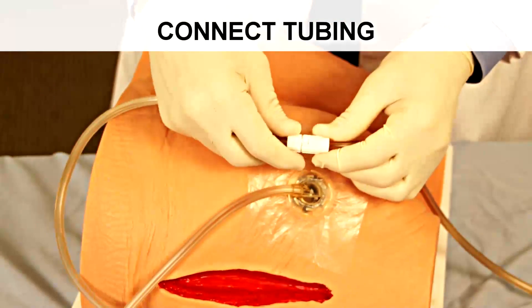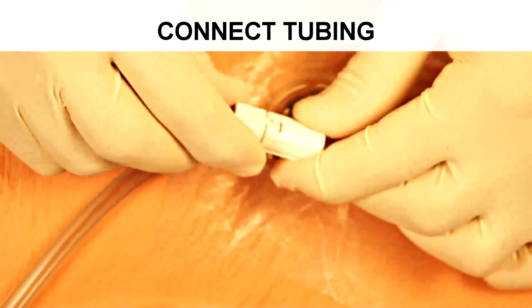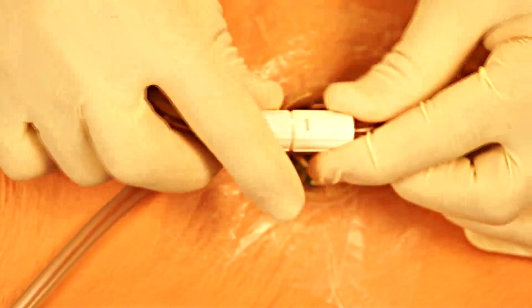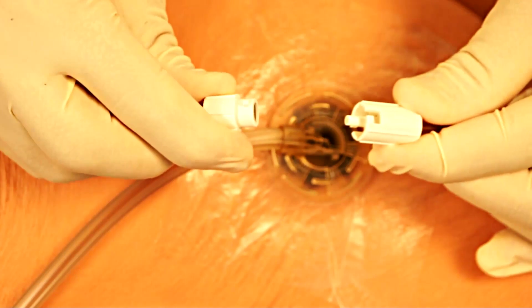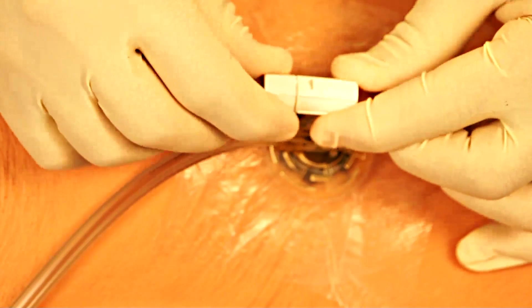To connect the device portion of the tubing to the patient portion of the tubing, one would push the female and male end together, push down, and turn part of a turn to lock. Similarly, you would turn and pull this apart to disconnect the patient from the generator.